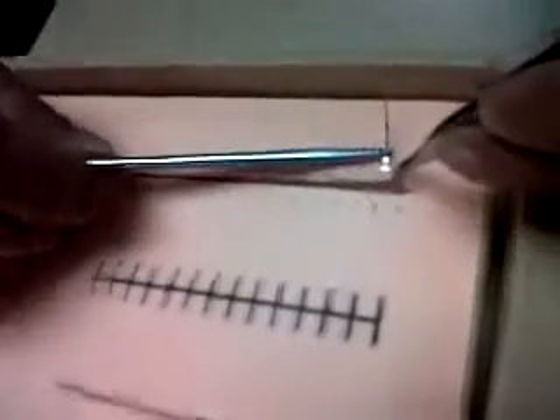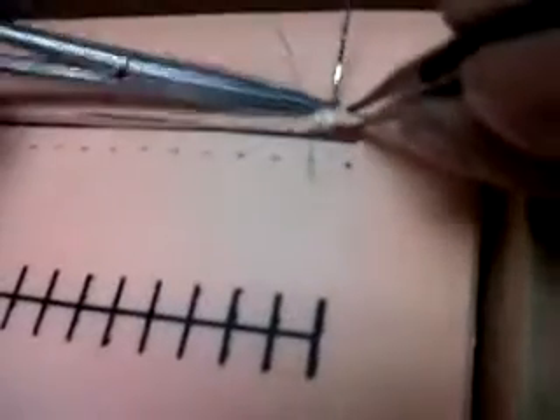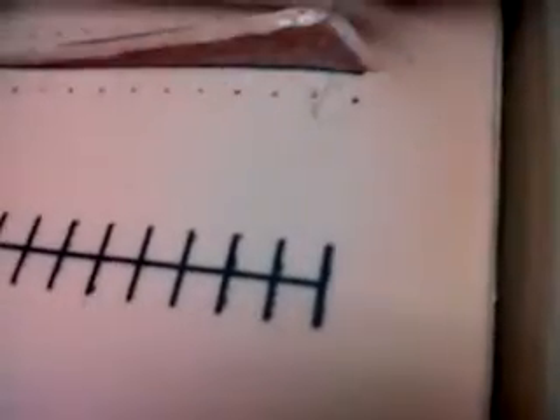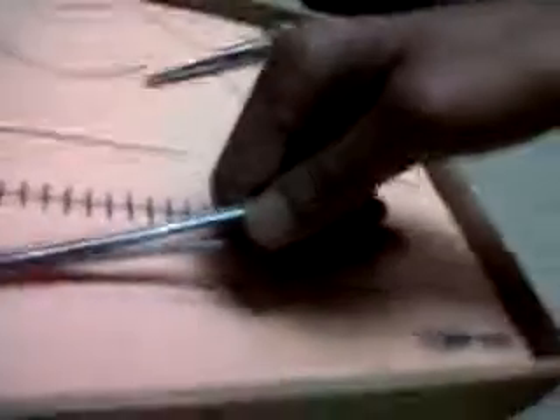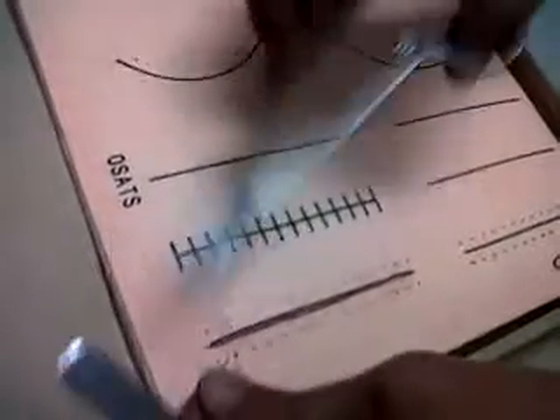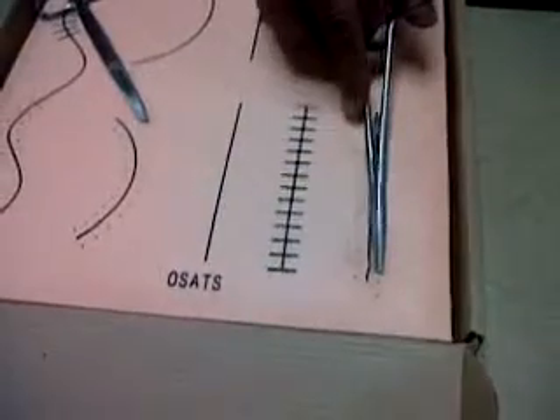Now we have to go very precisely at the dermal-epidermal junction — this is the dermal-epidermal junction. From this side and the same thing from the other side also. You pick up this end and again at the dermal-epidermal junction — push and take it out. What we have achieved is union of the epidermis to the epidermis and the dermis to the dermis.